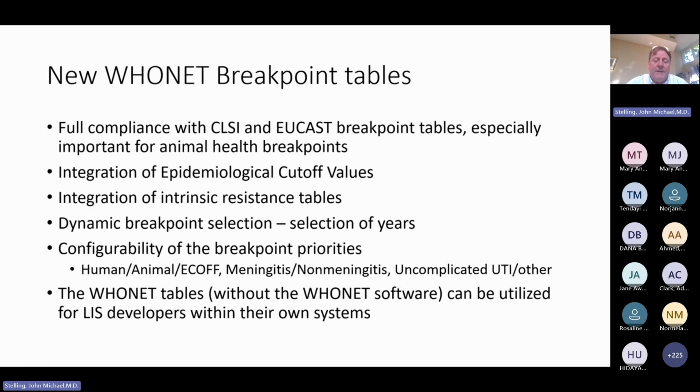The bottom line is we've had these new tables available for many years, and many of you do use the new tables, but we are now changing the new way to be the default. So the difference is not that we're putting something new in, but that we're changing the new way to be the default.